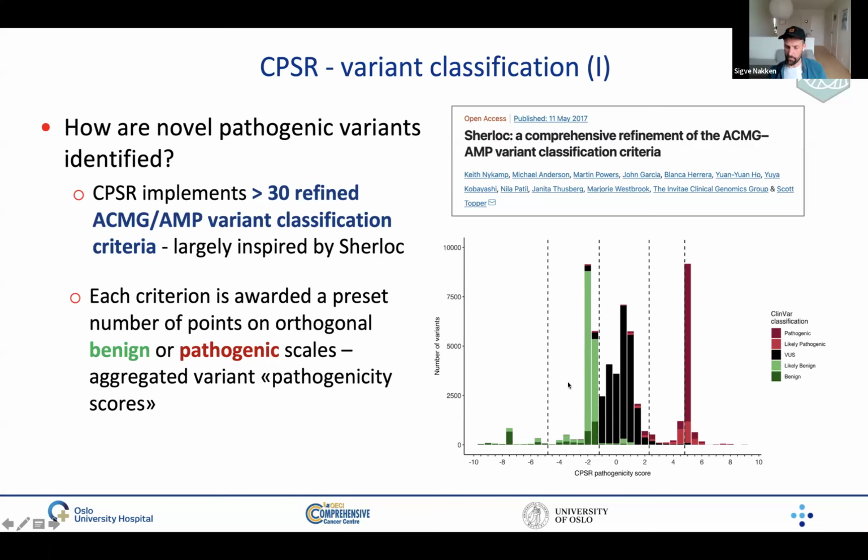There are, of course, these borderline cases where you have almost a similar amount of pathogenic cases and also variants of uncertain significance, but in the reporting from CPSR, we highlight this to the users, that you should pay close attention to those variants that are difficult to classify.